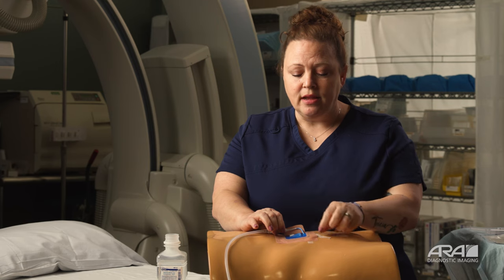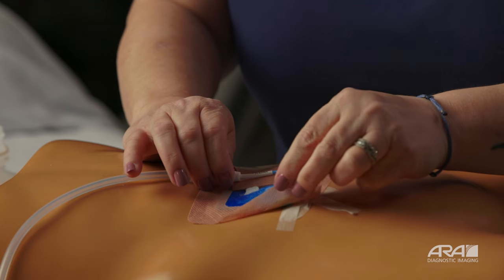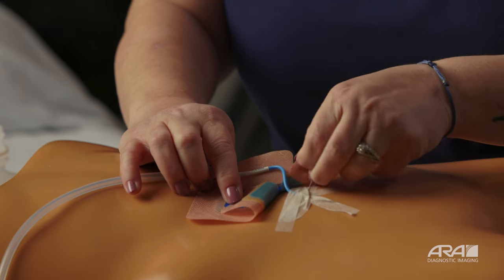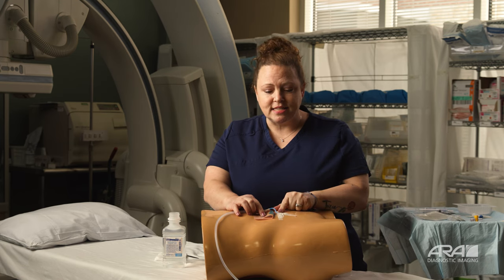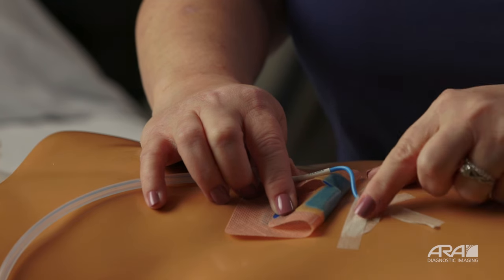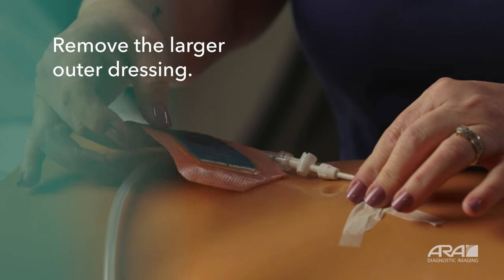Holding your drain as best you can, go ahead and start removing your outer dressing — this is the dressing that touches your skin. As you start peeling this up, you may notice you're leaving behind a little adhesive. That's okay, that's normal. Start removing it all the way around the drain, keeping your hand on the drain if possible so as not to dislodge anything. Note: this torso does not actually have a drain in place, so you'll notice white strips of tape holding the drain to the body — when you remove your dressing, you will not have these. Slowly remove your adhesive, using alcohol prep pads or warm soapy water as needed to pull it away easily.